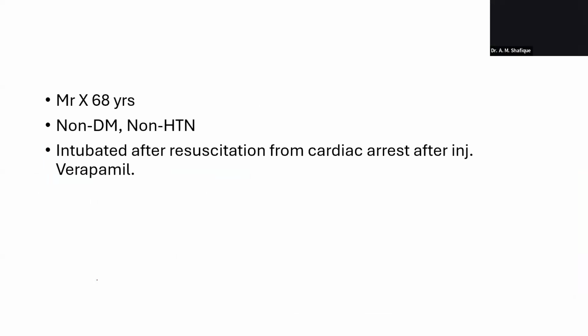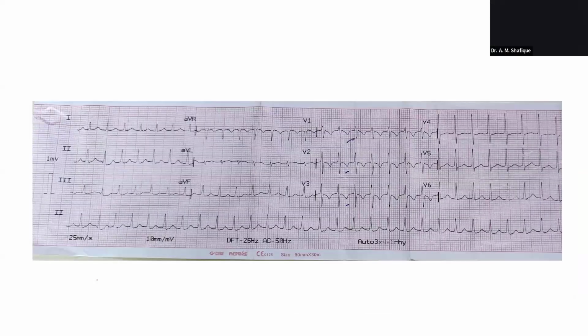A 68-year-old male, non-diabetic, non-hypertensive, intubated after resuscitation from cardiac arrest after getting an injection of verapamil. Actually, this ECG is not from our hospital. This was outside the hospital, where the patient had this ECG, was treated with verapamil and reverted to sinus rhythm. Then the patient again developed symptoms and came to our emergency department.